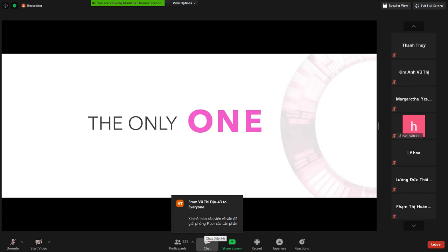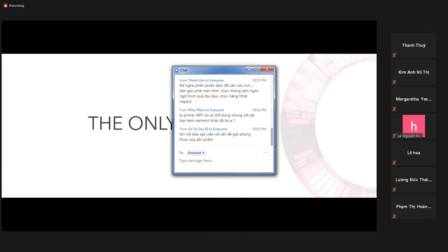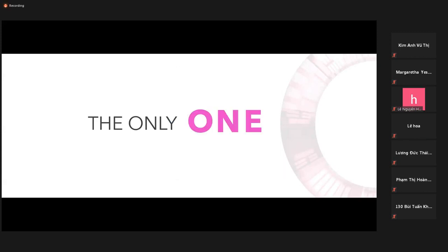Another question about the AEP. A doctor wants to know, can he use the AEP with other resin cement, without GSEM1? Sorry about that, but the AEP is specifically meant to be used with the GSEM1. That touch cure effect comes into effect only when the GSEM1 cement touches this primer surface.